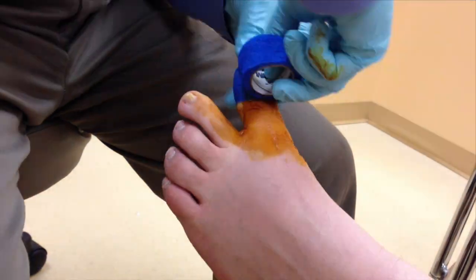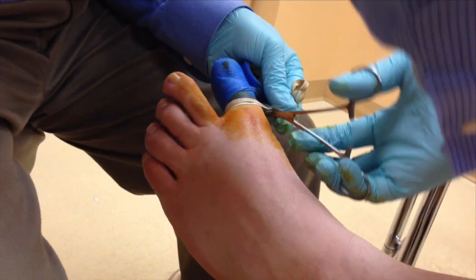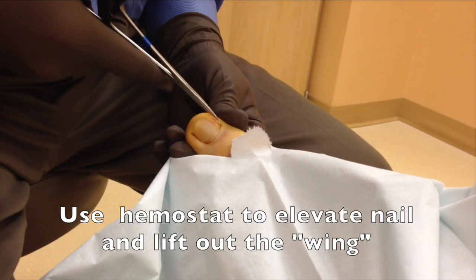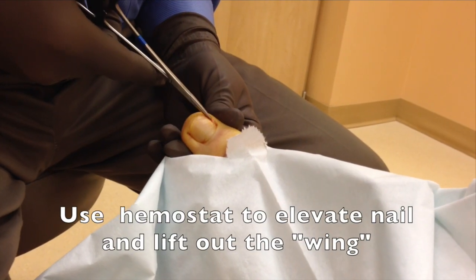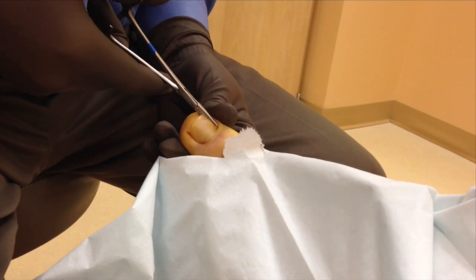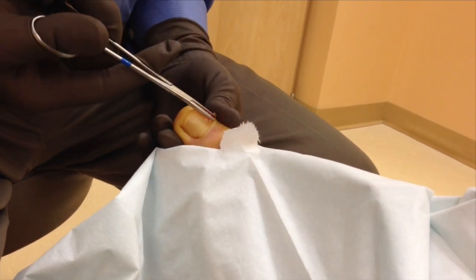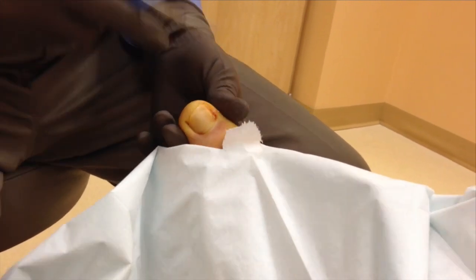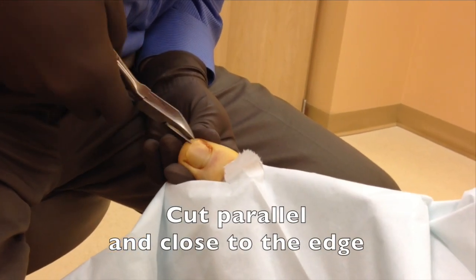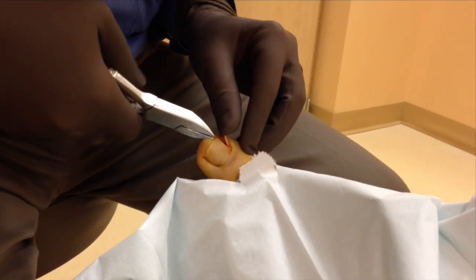Wrap the toe tight with co-band to exsanguinate the toe, then apply the tourniquet. I find it easiest to use a hemostat to elevate the nail — make sure you slide it all the way down to the nail bed, then clamp and lift out the wing. Cut parallel to the nail. Remember, you only need to take a small portion, so stay pretty close to the edge.